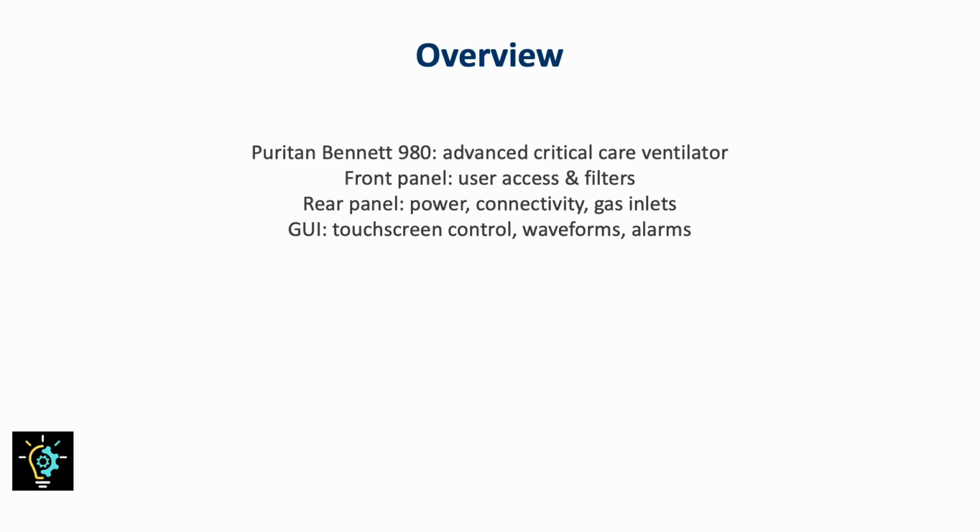The PB980 is one of Medtronic's most advanced critical care ventilators, and its design shows how usability and serviceability are balanced. On the front panel, you'll find all the primary access points like filters and user displays. On the rear panel, it's all about power, connectivity, and system expansion. And finally, the GUI ties everything together. It's the brain and the face of the system, where clinicians spend most of their time.